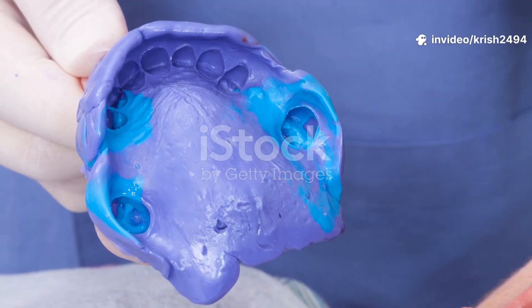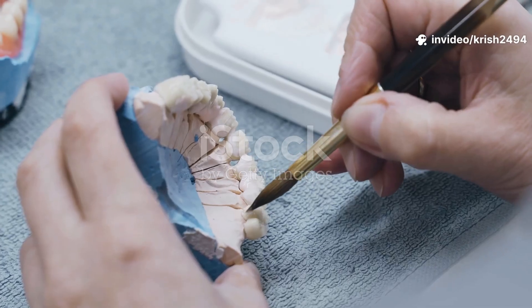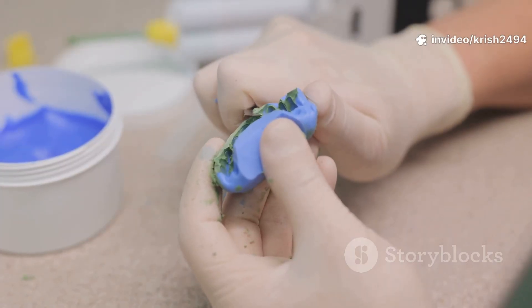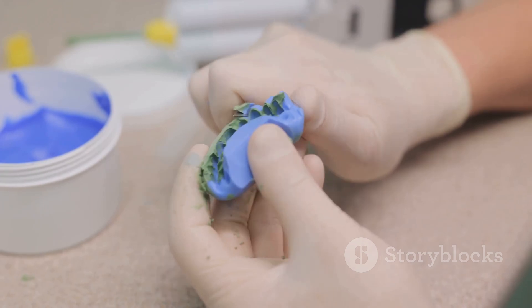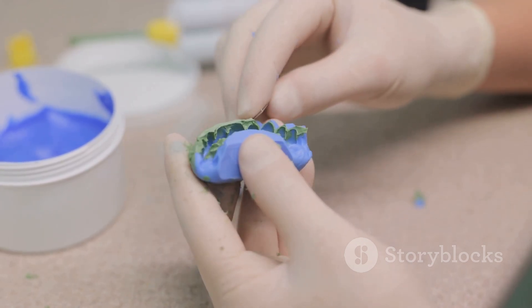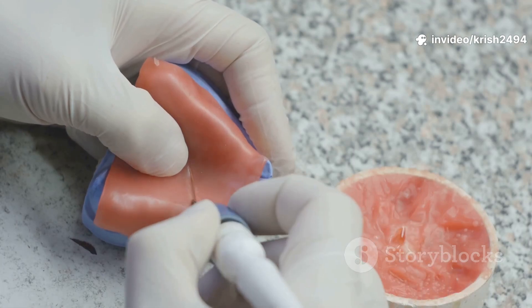Step 1: Initial Impressions. The dentist starts by taking a quick impression of your gums using stock trays and a gooey material called alginate. This creates a rough model of your mouth — kind of like a first draft — so the lab can make trays that fit you perfectly.